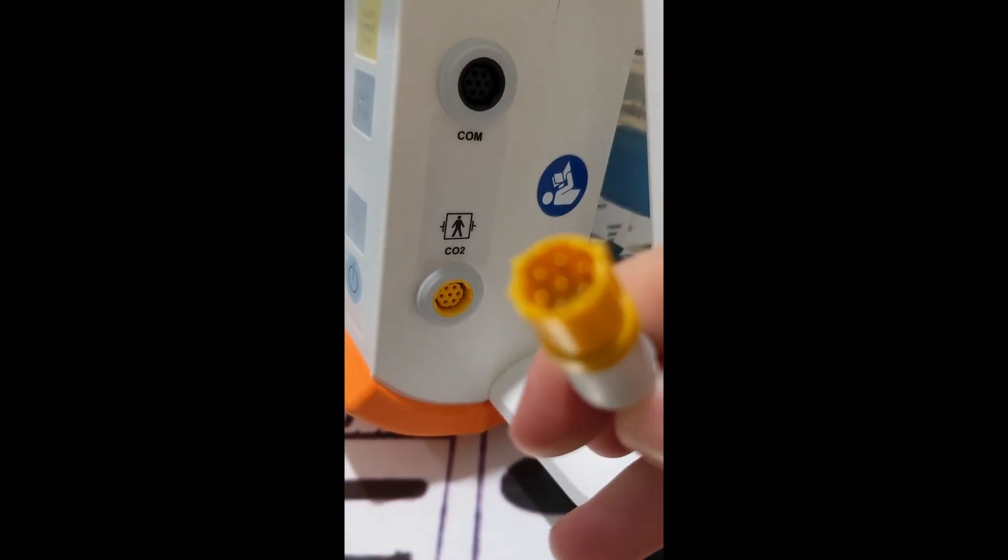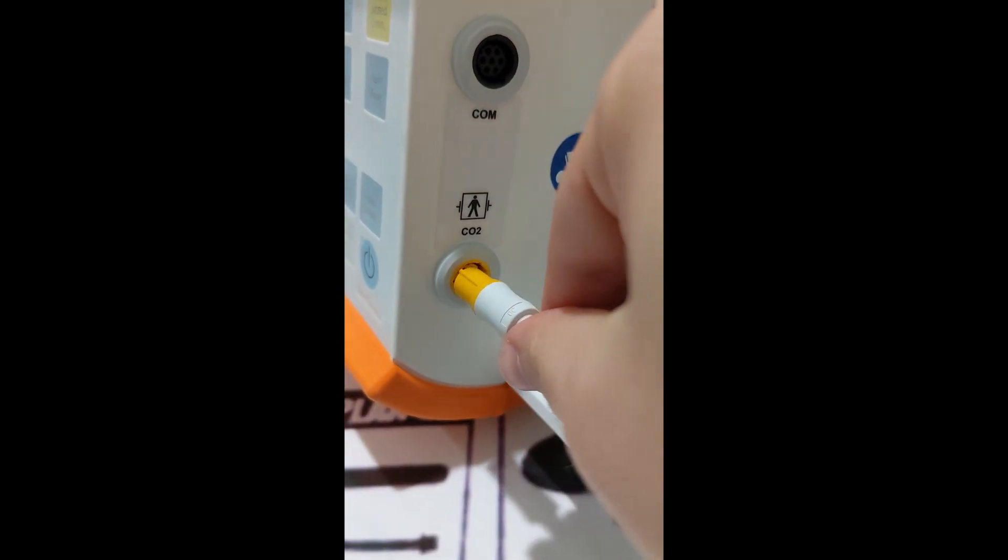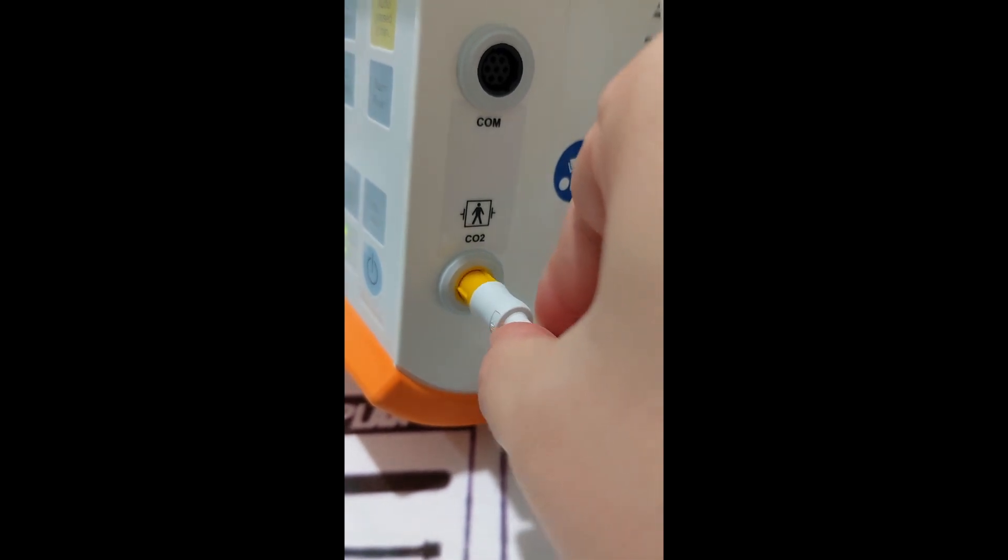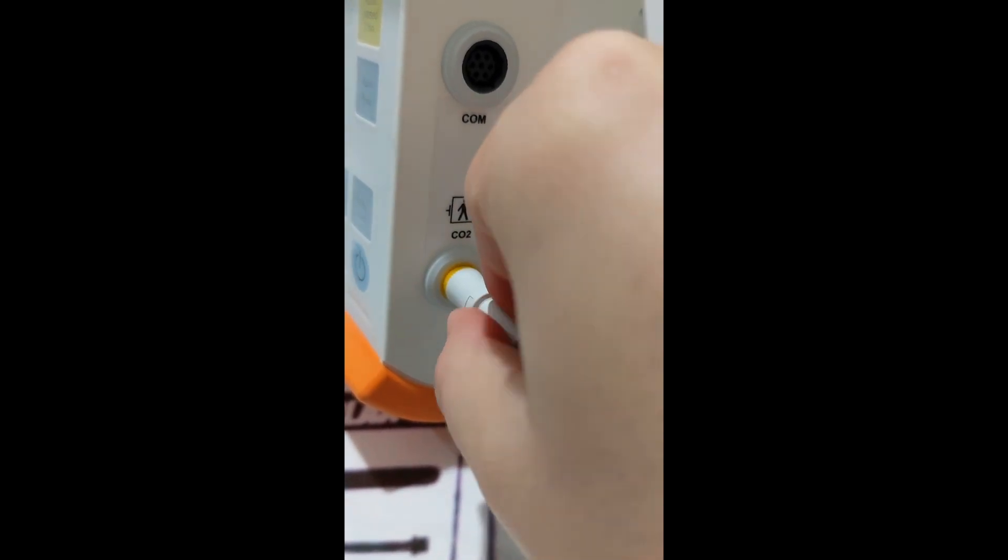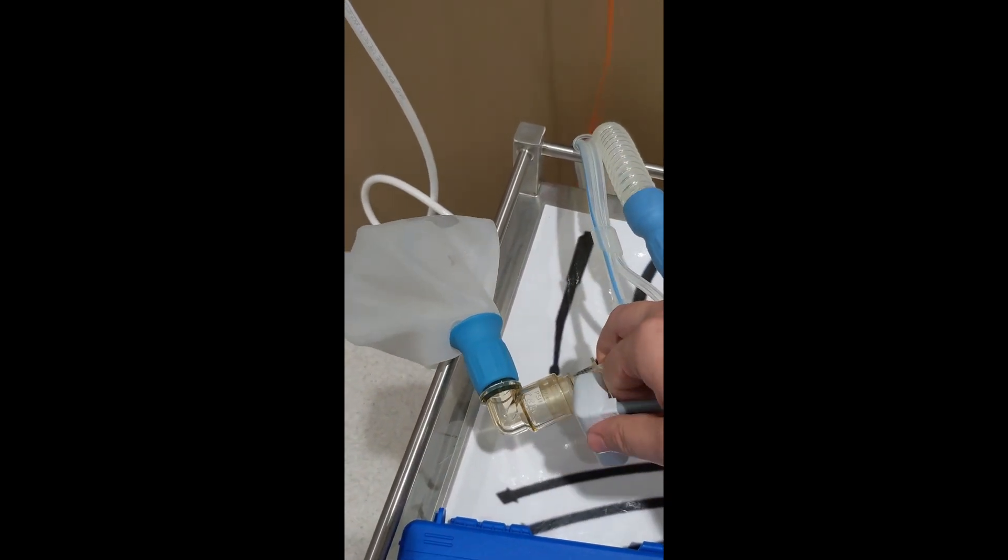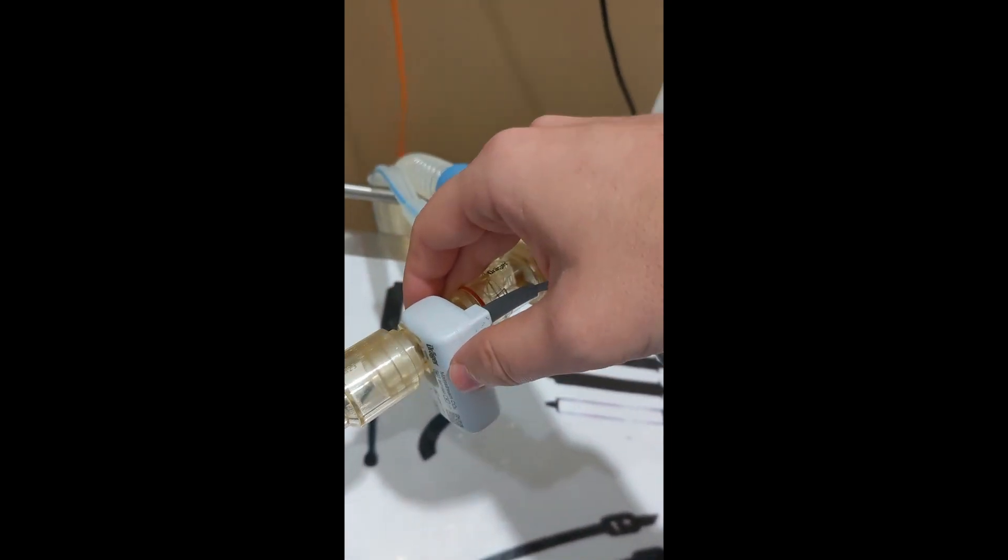Attach the Entitle CO2 monitoring to the side of the OXYLOG machine. The Entitle CO2 connector only fits one way. We then connect the monitoring to the cuvette which has been placed in the circuit and make sure it's secure.